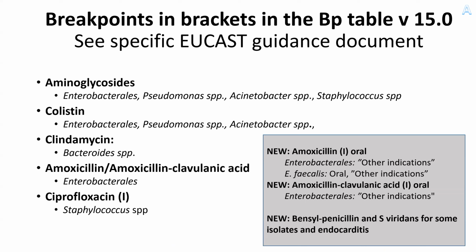That goes for amoxicillin oral, other indications for both the Enterobacterales and Enterococcus faecalis, where the amoxicillin now is classified as an I within brackets. And the same goes for amoxicillin clavulanic acid oral for Enterobacterales and other indications. And then we also have a new breakpoint in brackets for benzylpenicillin and viridans streptococci endocarditis isolates, but Karianna will tell you more about that later.